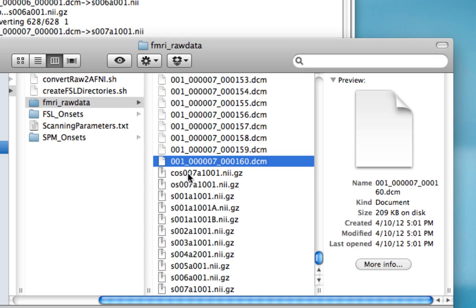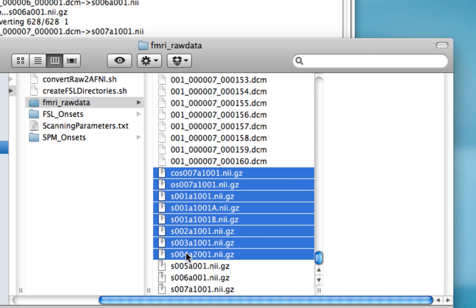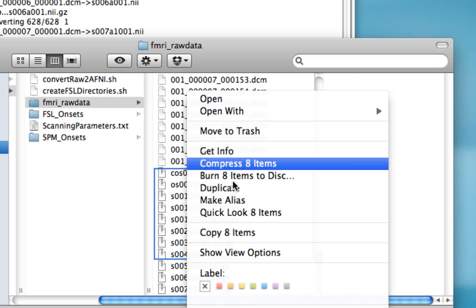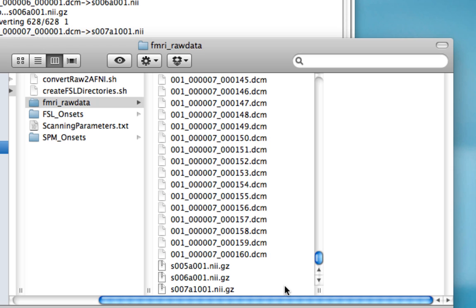For now, we're not going to focus on those, so we can go ahead and delete them. After you're done, you can use this to then convert all your other DICOM files for your other datasets.